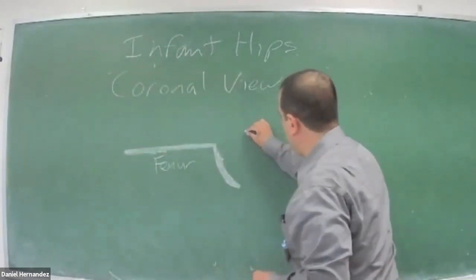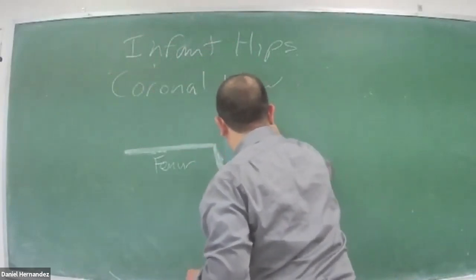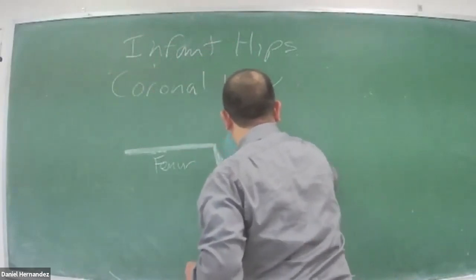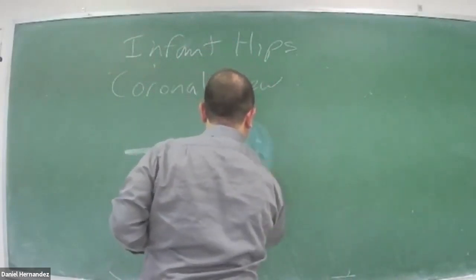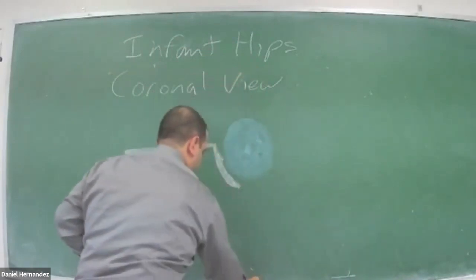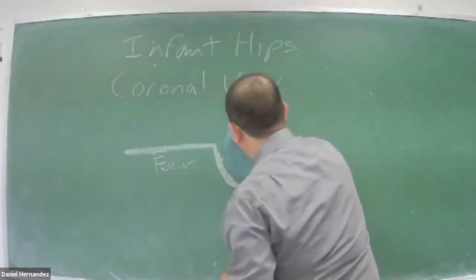In that area, we're going to have a femoral head. This is our femoral head.